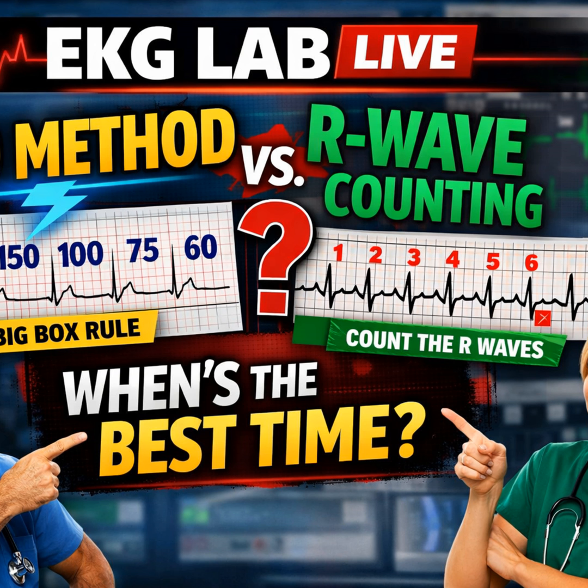So I'll start. I'm going to stake my claim for the big box method as the superior standard for the competent clinician. When you look at the source material from UNC, the EKG isn't just some drawing, it's a graph. It's voltage over time on a grid. To ignore that grid is to ignore the entire instrument. Okay, I don't ignore the grid. I just don't worship it.